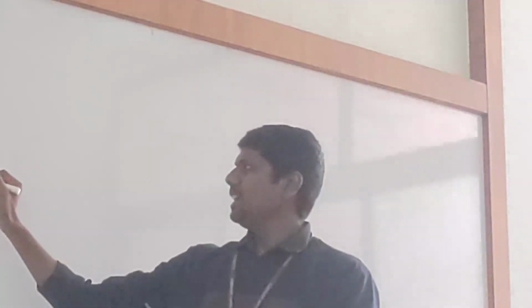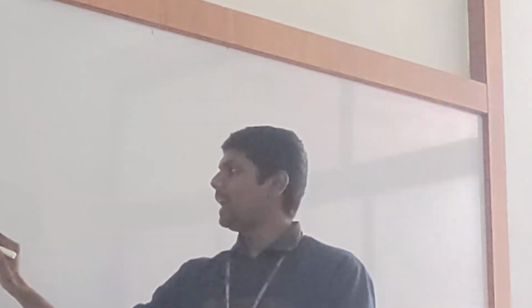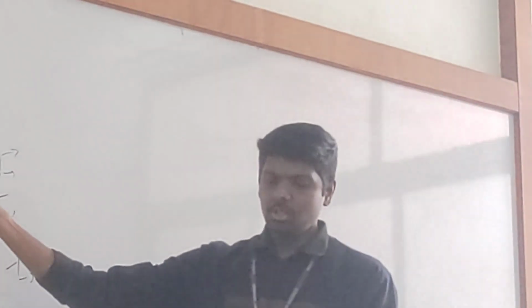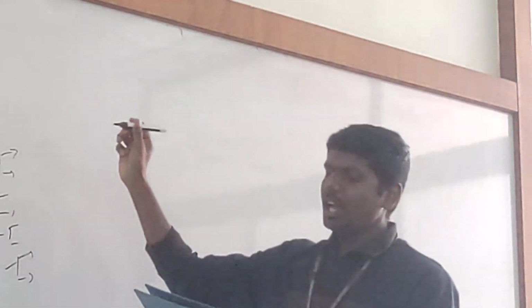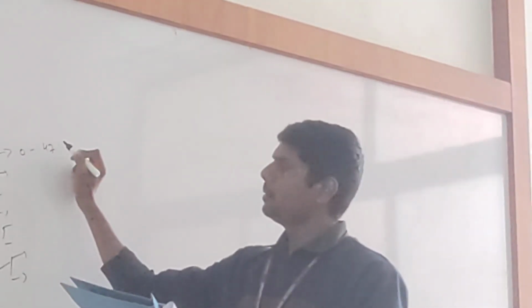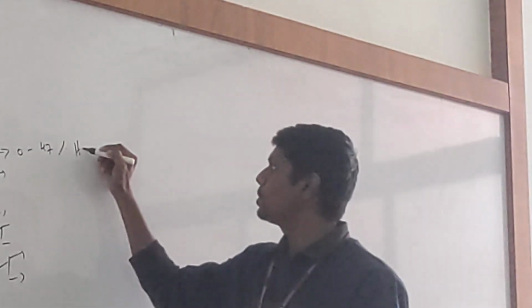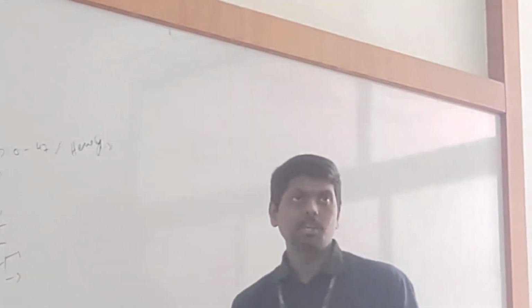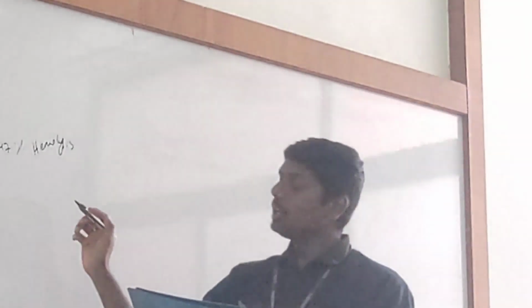Again, here we have male and female values. Write down. In case of the 0.5 hypotonic solution, 0 to 47% hemolysis should be observed in males, and 0 to 45% in females.